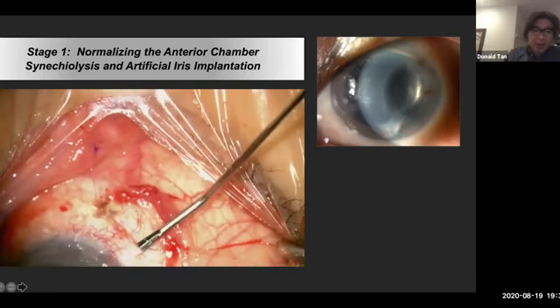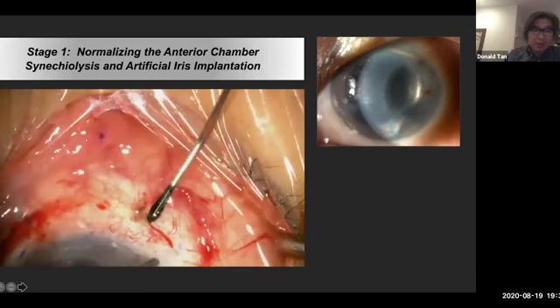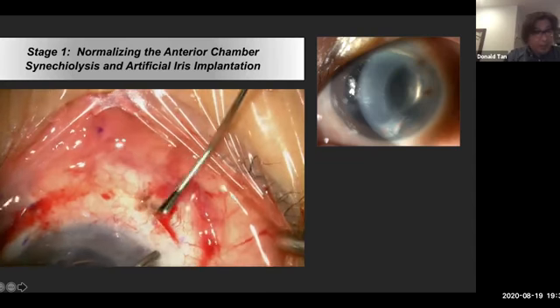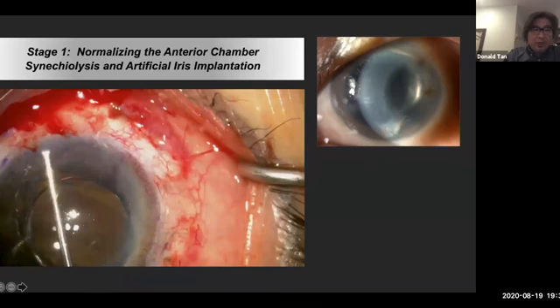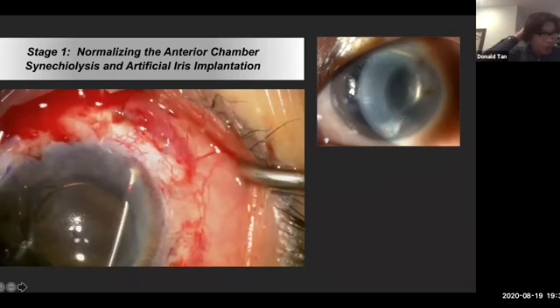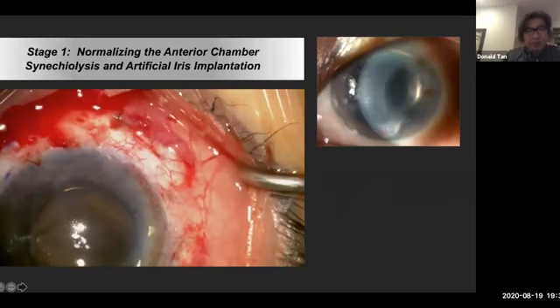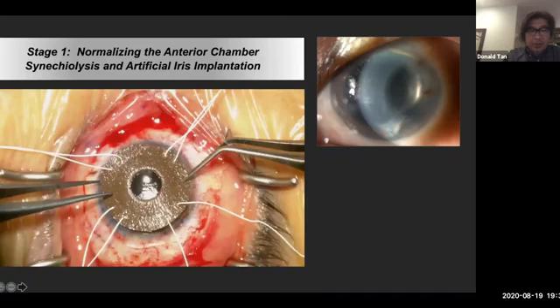and then on either side, I would penetrate through with the MVR blade, making sure that I can see my blade going through the iris here. I can see it behind rather than in front. So this helps you to gauge. And once you've done all of these stab incisions, then this is the marginal dissector to break the peripheral anterior synechia. This marginal dissector is from Asico. I use it for DALK, but it's great to break any peripheral anterior synechia.